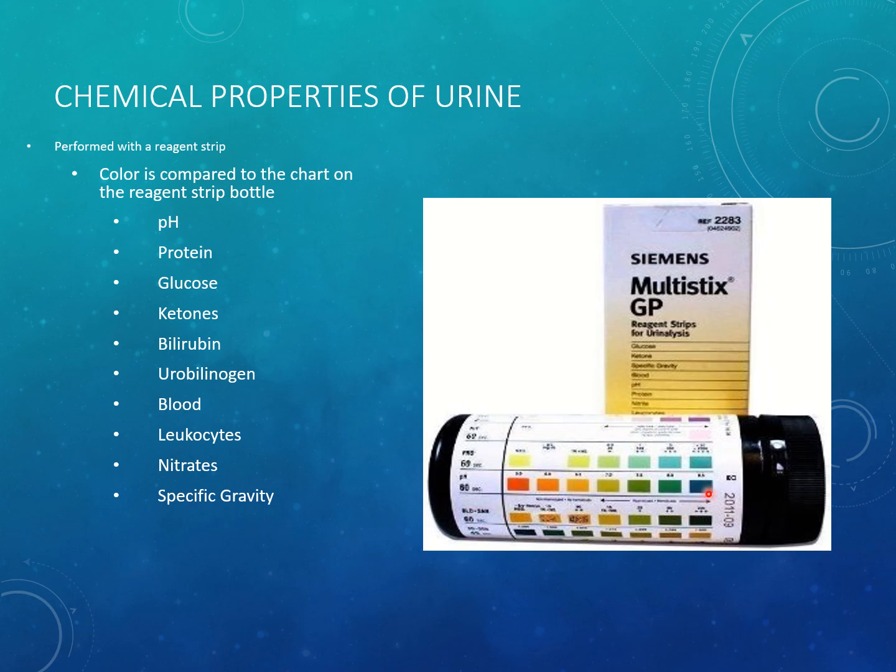And this is why labs ask for like 5 mLs of urine, for example, if you're sending something to IDEXX, because the correct way to do it is to submerge it. Now, some machines nowadays, like the SediVue, for example, will analyze the strip for you. They'll even look at the urine sediment for you.